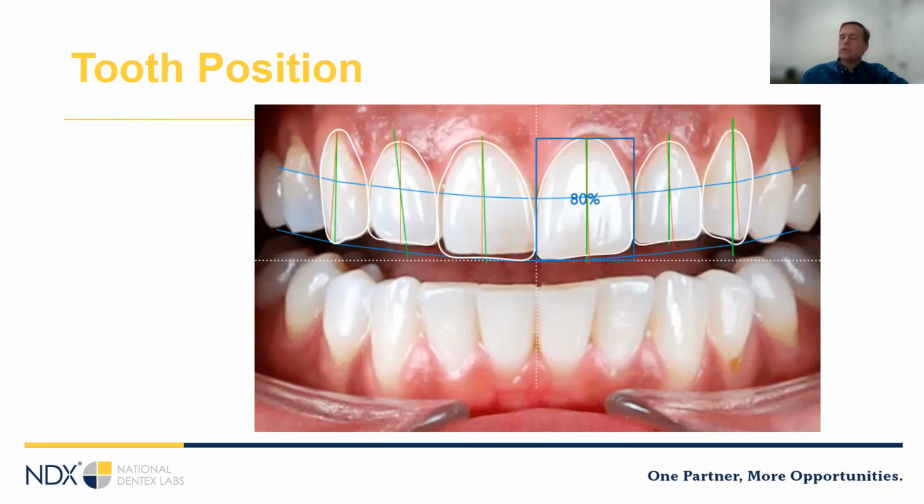And one other trick that I think is pretty important is when you're preparing this margin and this margin, the mesial margins of the maxillary centrals, try to prepare them as symmetric as possible, and keep in mind that from an aesthetic perspective, you're better off putting the contact directly between the two centrals than aligning it with the facial midline or the lower midline.